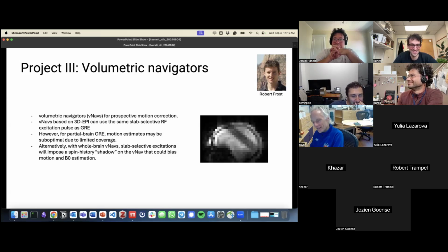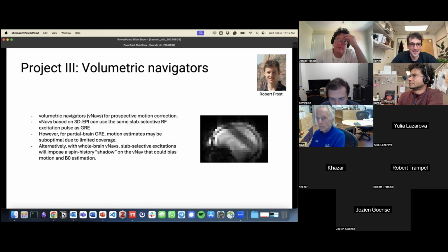So the multi-echo for the fMRI wouldn't work there either, right? Because now you get a BOLD noise that you can't really remove. It has the same echo time dependence as neural activity related BOLD signals. So yeah, that's a big challenge. Well, thanks for the input anyways. You're welcome.